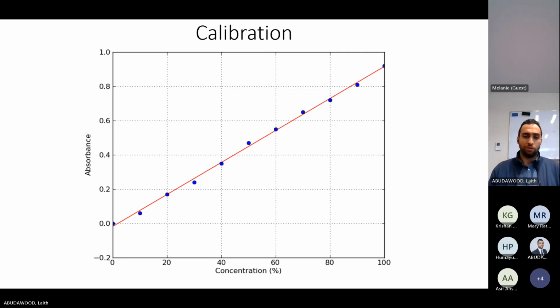So a few pieces of information. First of all, calibration and why it is important for what I'm talking about. Calibration, as you may already know, is simply a way for you to convert one unit into another unit. For example, D-dimer is a photometric assay, meaning the analyzer measures optical density.